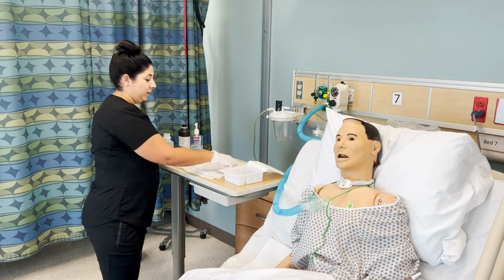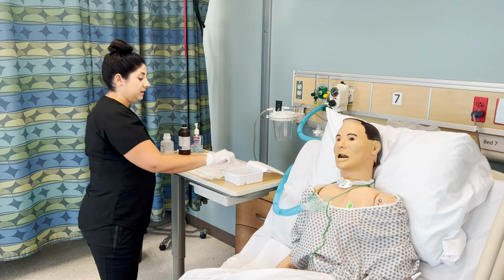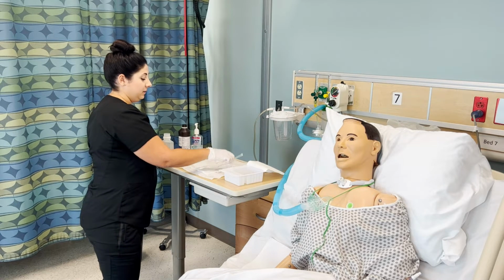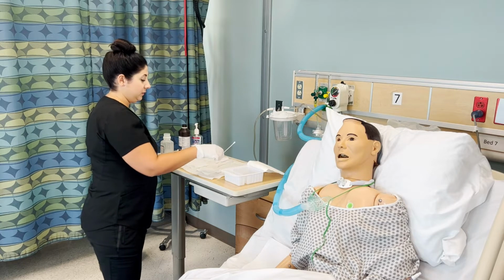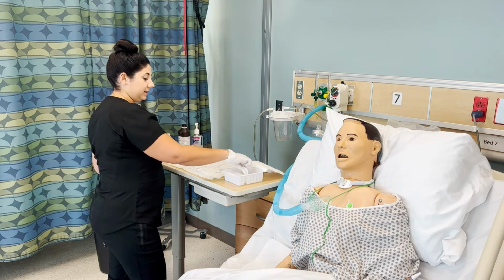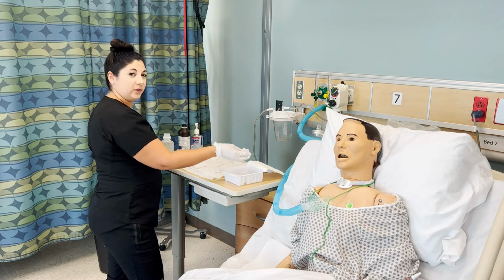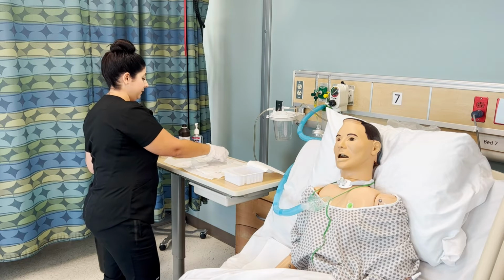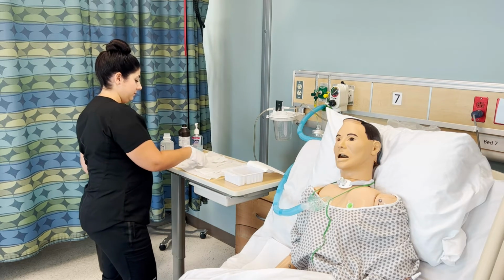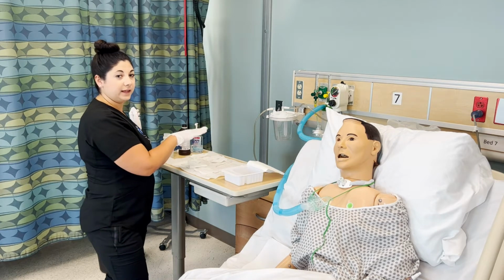Now I will moisten my Q-tips and my gauze. So I'll get one Q-tip in the hydrogen peroxide solution, one Q-tip in the saline solution, and then I will get one gauze in the hydrogen and saline solution. Squeeze that out a little so it's not dripping too much, and then one in just saline. I'm going to leave the other two dry so that I can clean after.